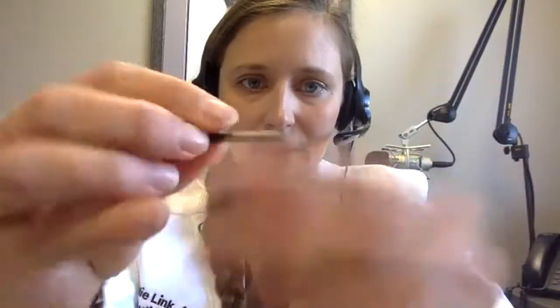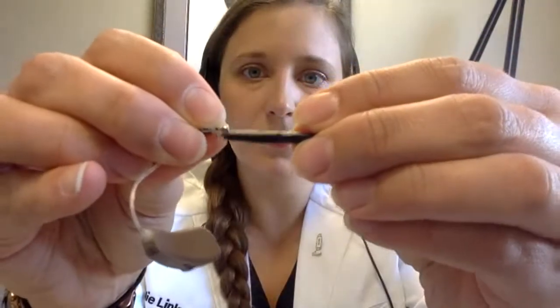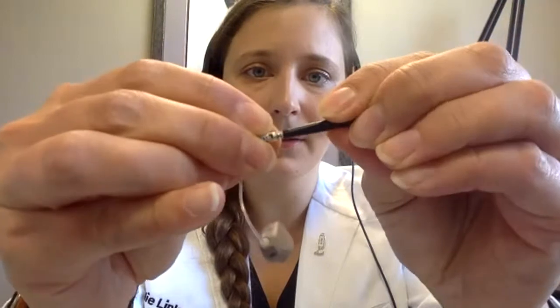So once you get that off, you can see there's a little white piece in there. That's going to be your filter. So in your supplies, you should have a little packet like this. It might be a different color, but inside here are going to be little sticks. Each one of these sticks has an empty end on it and a new filter on this end. So what you're going to do is take that empty end, line that up here like that, okay? And then you're going to pull out that filter. Now we're going to have a new filter on this end, go in just like that, okay? And then pull that stick out.